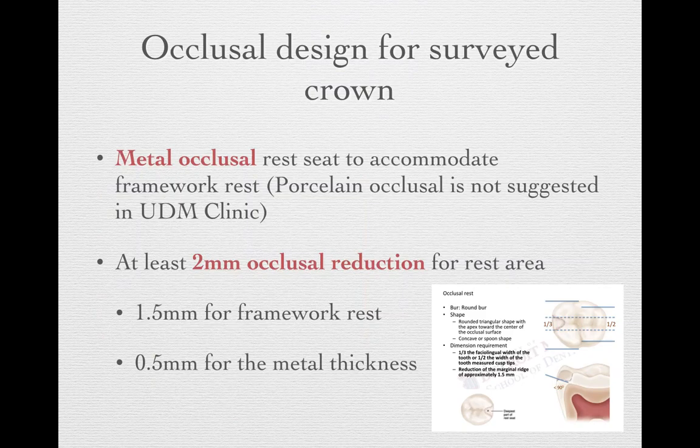So when we look at the occlusal design for the survey crown, ideally we make a metal occlusal rest seat to accommodate the framework rest. I'm not saying that the PFM, the porcelain part, will not be able to be a rest seat area design. However, in the UDM dental clinic, we will more likely use a metal occlusal because it avoids porcelain fractures in the future.